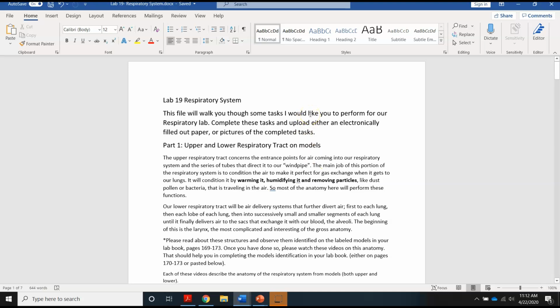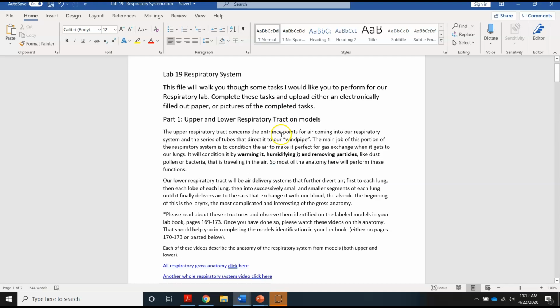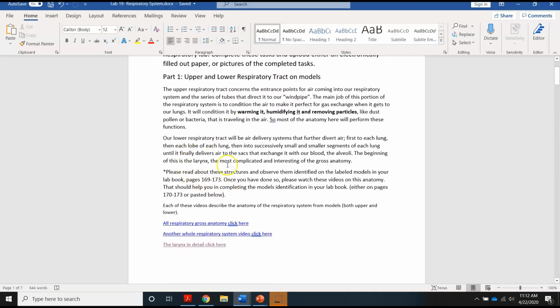This video is going to be talking about the histology for Lab 19, the respiratory system. I just want to talk a little bit about the other parts of this lab. In the beginning, I would like you to read your lab manual from page 169 to 173, talking about the different anatomical structures that you can find in gross anatomy of the respiratory system, stuff you could probably see with your eyes if your eyes were good, and also identifying that stuff.